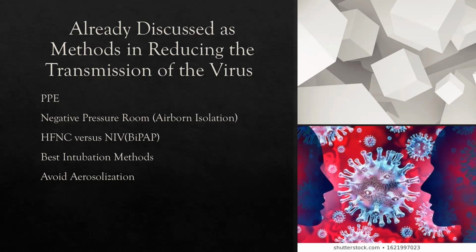Because if you're next to the patient, even though it's a negative pressure room, they can still be putting the virus into the air. So they're showing high flow nasal cannula with the patient having a mask on their face, like a surgical mask. All right, so I don't have any hard and fast answers for this. But because of the high flow, it does put the virus into the atmosphere.